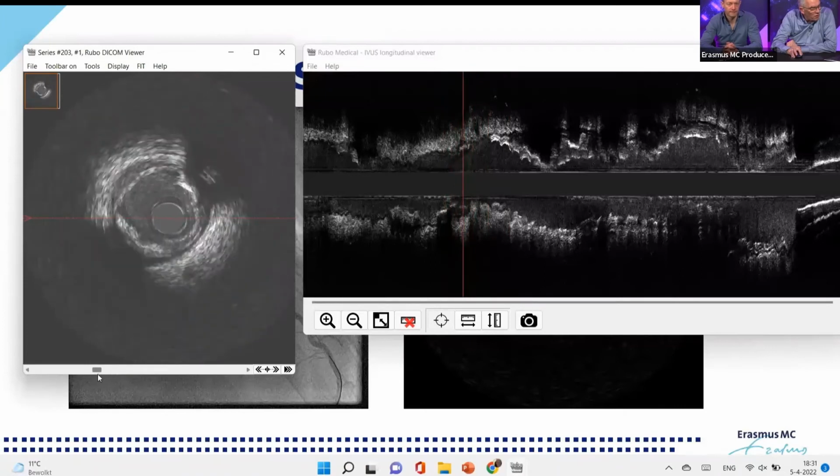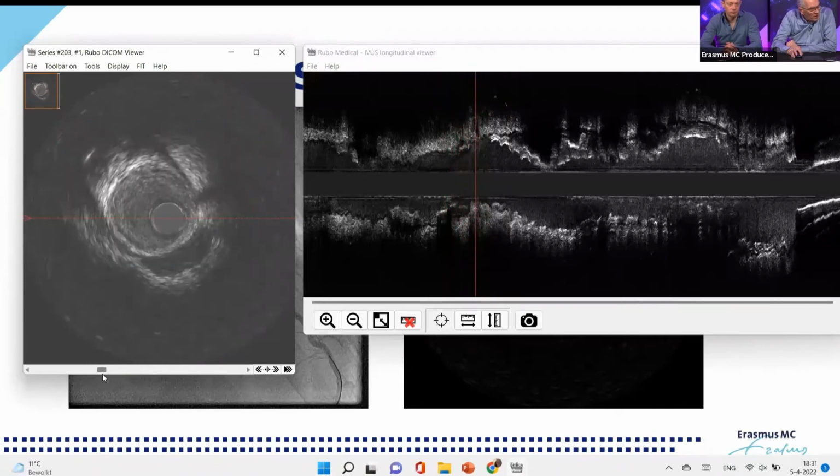It's not relevant. But I even think that it's not even submedial. Could be, but could be even subadventitial. You're right. And that sounds more like extravasation. No, that is correct.